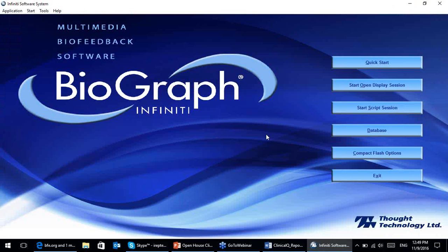And so the software manual will be updated to reflect the new updated software, so that'll be great. You'll be able to look at that. And one other thing, another reminder is that, don't worry, all this new stuff, when we install it, it doesn't replace your old stuff. So don't worry about losing the old version of the suite or old data or old sessions. It just coexists with it. It exists next to it, and you still have all the old stuff available.